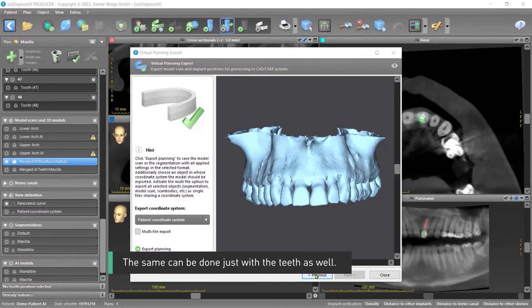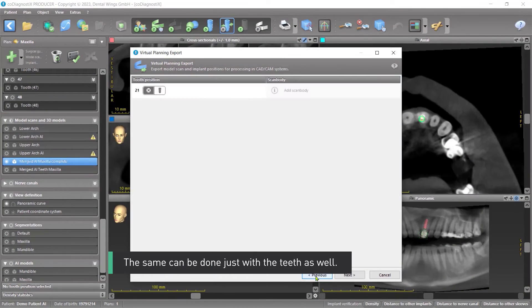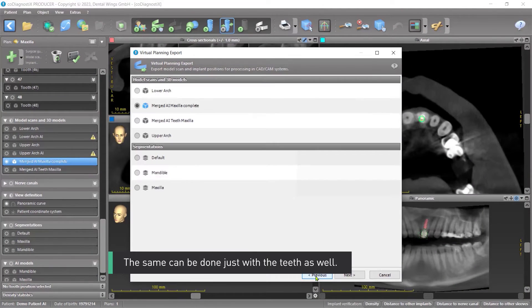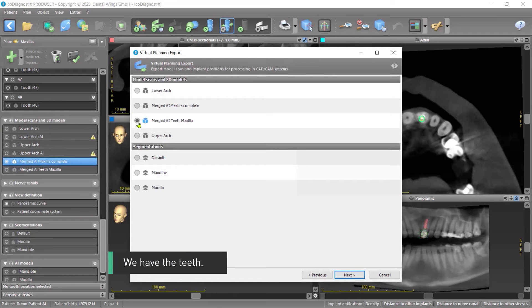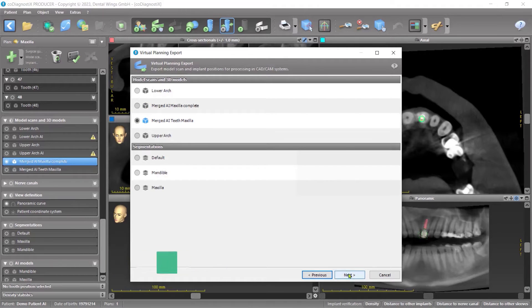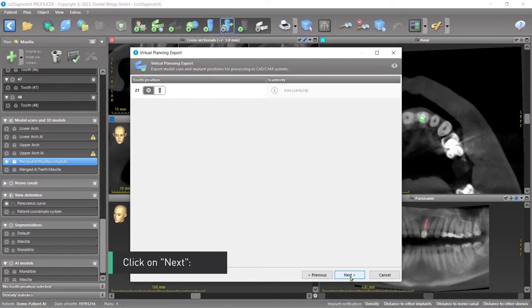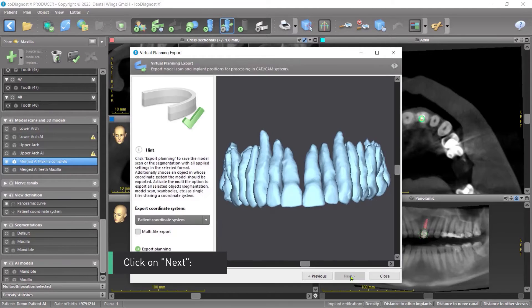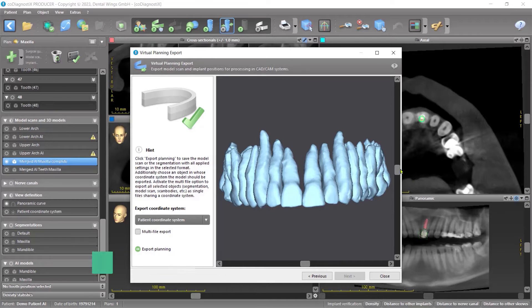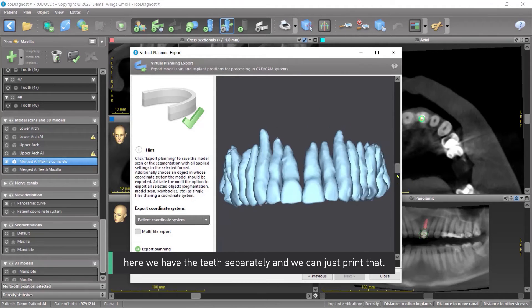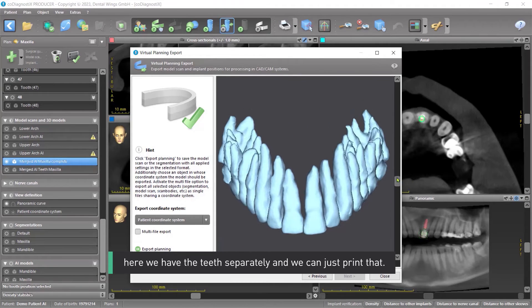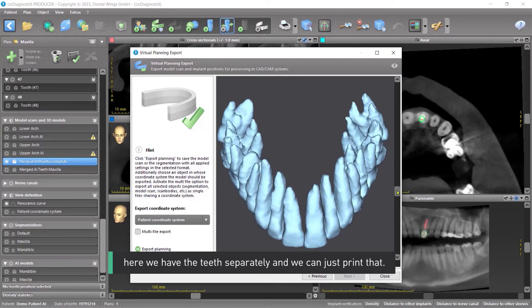The same can be done just with the teeth as well. We have the teeth. Click on Next. Here we have the teeth separately. And we can just print that.